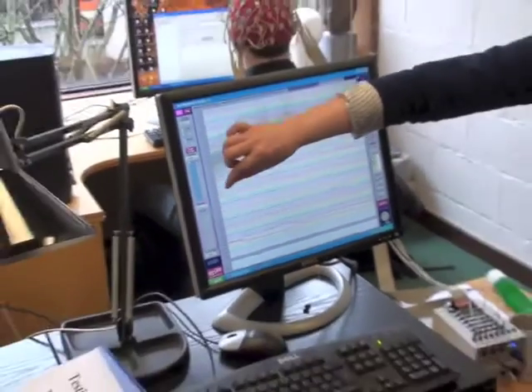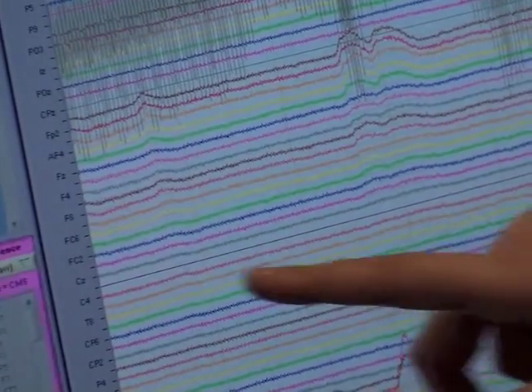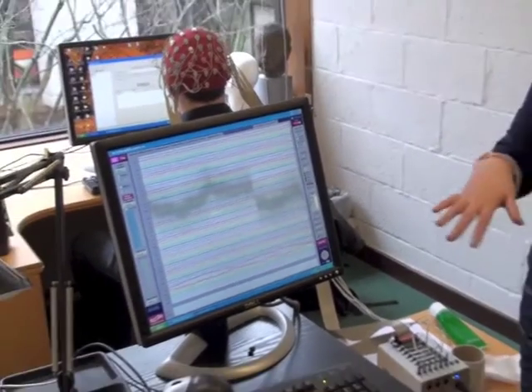But each little one of these coloured lines going across should be a little bit more spaced out. It looks like it's really, really busy. Each frequency line should be a little bit more relaxed. There is clearly 50 Hz electrical interference in the room. All I do afterwards is really easily click apply 50 Hz filter. It takes all that out and the data's really clean again.